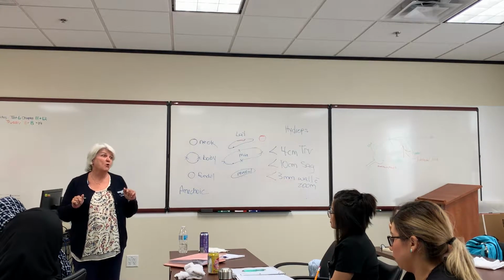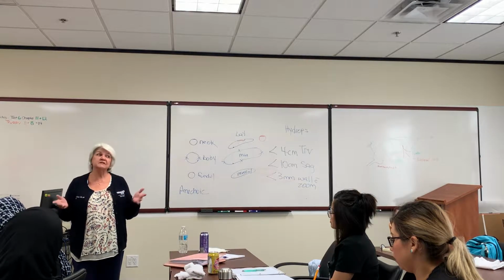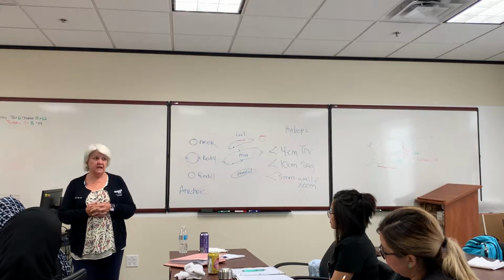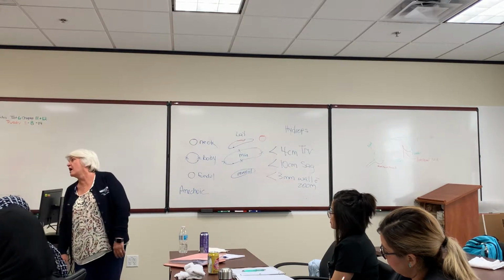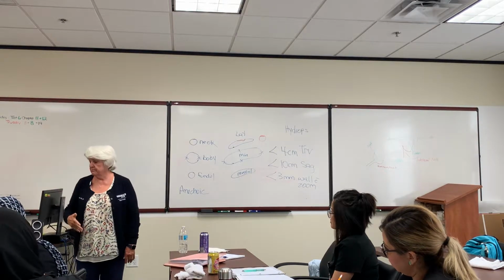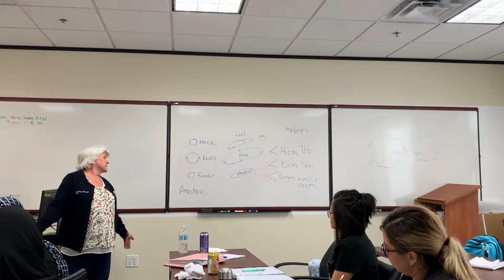Well, that looks like a hole. Well, that's because that's your gallbladder and it's full of fluid and it shows up black on ultrasound. Well, did you see anything wrong? Well, I'm not a doctor, I can't tell you. Okay? If they have bad breath, taking a deep breath. Because we do a lot of homeless. And yeah, so have them turn their head to the left, taking a deep breath, blow your breath out.